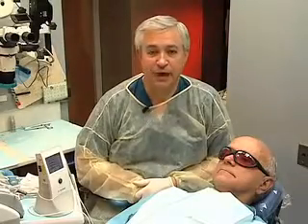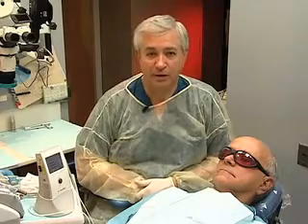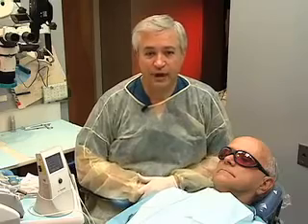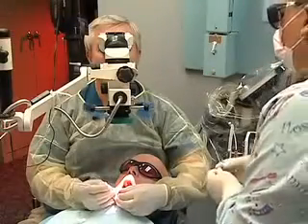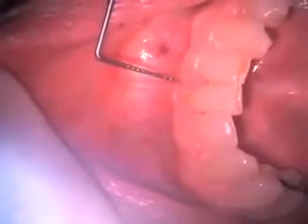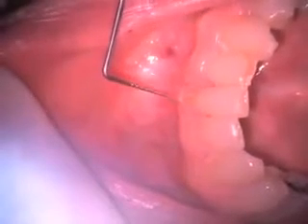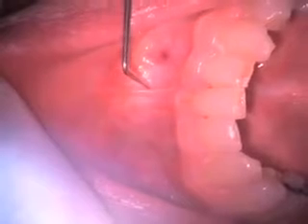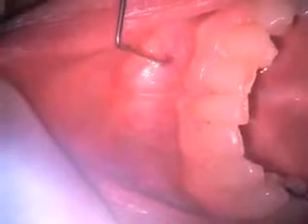Our patient Bob is going to be receiving a frenectomy of the lower anterior. He has had some periodontal difficulties because of the aberrant frenum and we're going to relieve that frenum for him. Our patient has been anesthetized. You can see that the frenum here has encroached upon the free gingival margin causing recession and loss of attached gingiva. So we're going to relieve the pull of this frenum by using the laser to remove and excise a certain portion of it.